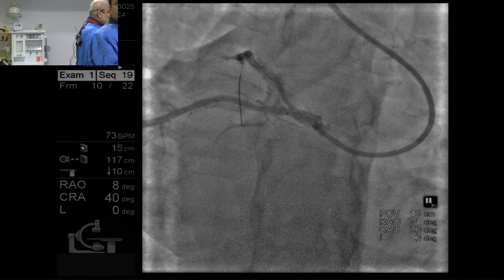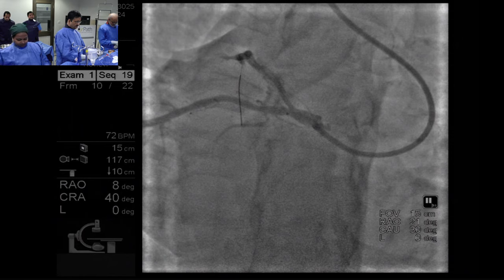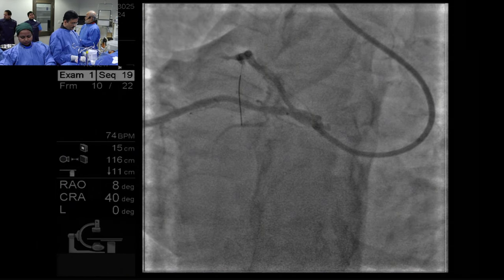Good morning, sir. Dr. Kiran here. Kiran, how are you? Fine, sir. I want to ask, while delivering the pulse with the IVL balloon, we are usually going up to 6 atmospheres. Is there any added advantage of going at higher pressure during delivering the pulse? No, that is not the company recommendation, but at times we go to around 8 or 10, not more than that. If you guys can throw some light on it.